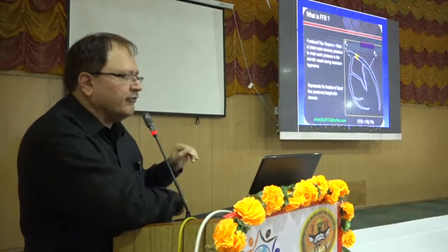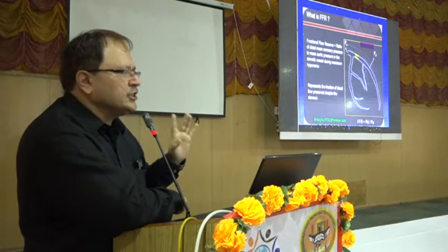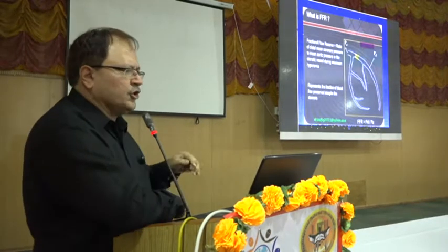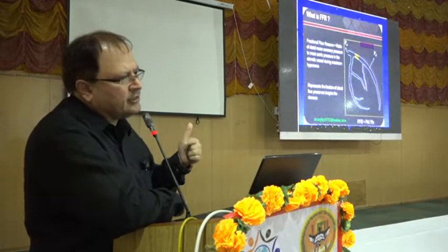If your FFR is more than 0.8, say 0.84 or 0.9, it means your lesion is not significant. Again, whenever we are in confusion whether we should stent this particular lesion or not, we do either FFR or IVUS or OCT.